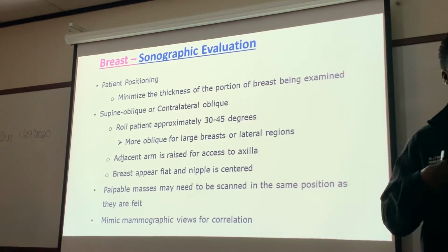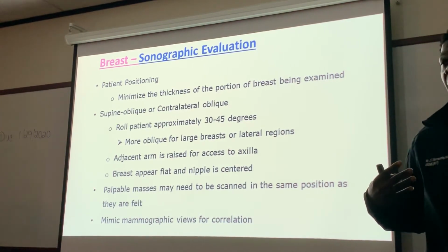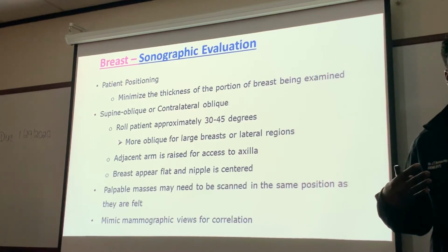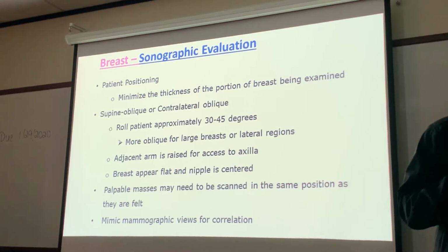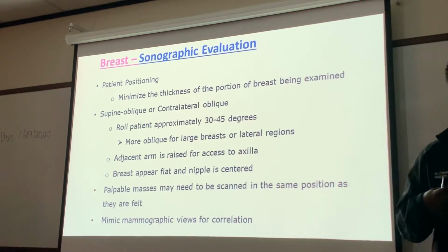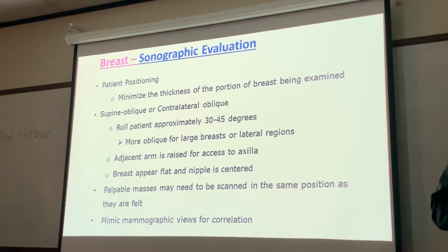Because we know sometimes breasts can just splay out, right? If you're laying flat, they'll just go to the side. So you're just trying to get them as flat as possible. That's the most professional way I can say that, guys. You want to put the nipple in profile. Exactly, right there. I like that. Get that breast to be as even as you can, so you'll turn that person up to the upside breast, okay?